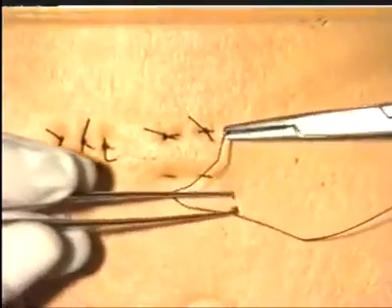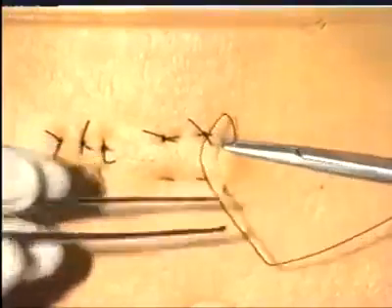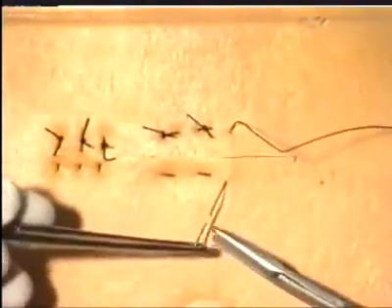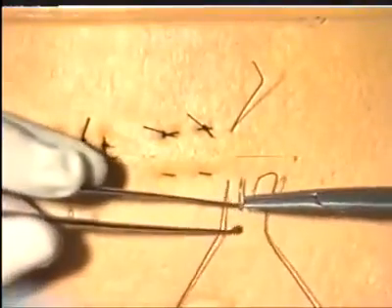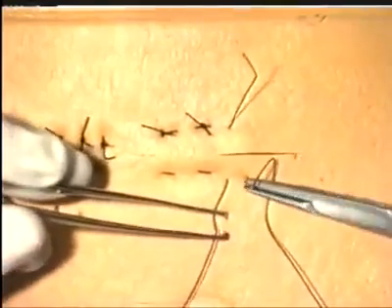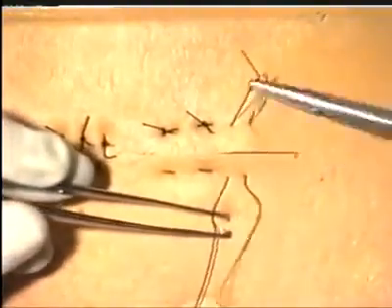Both vertical and horizontal mattress sutures can be useful for ensuring eversion or inversion of wound edges. And this is clearly demonstrated by diagrams in your handbook. The difference between the vertical mattress suture and the horizontal mattress suture can easily be seen in this demonstration.